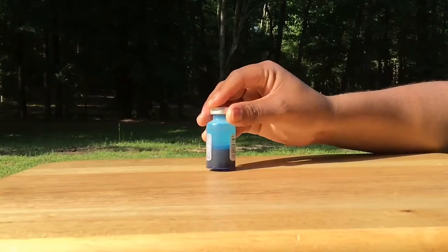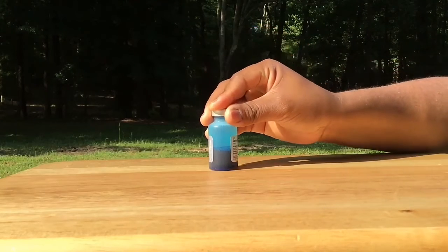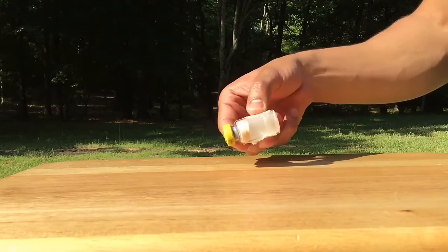The diluent is used to reconstitute the virus. It contains a blue dye so you can see where the vaccine went into the birds. The Fowlpox vaccine bottle is smaller and contains a dry disk of live virus.